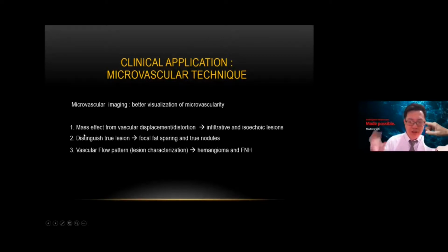We can use SMI for mass detection and to distinguish between pseudo lesions and true nodular lesions. And also, with the special vascular patterns, we can call hemangioma and FNH. This is the add-on, the first application of SMI.